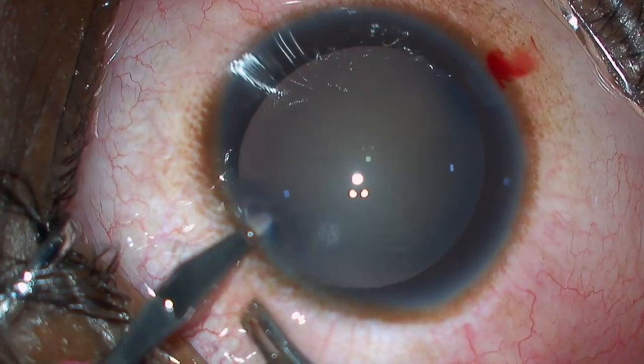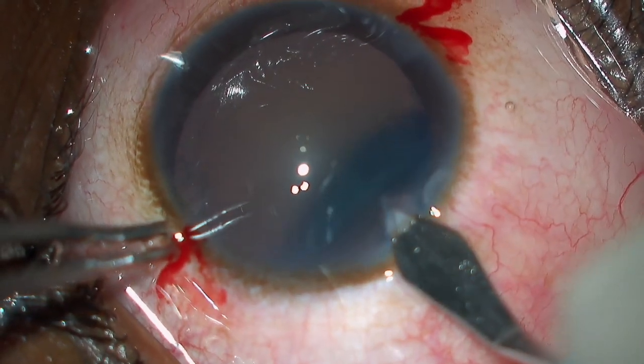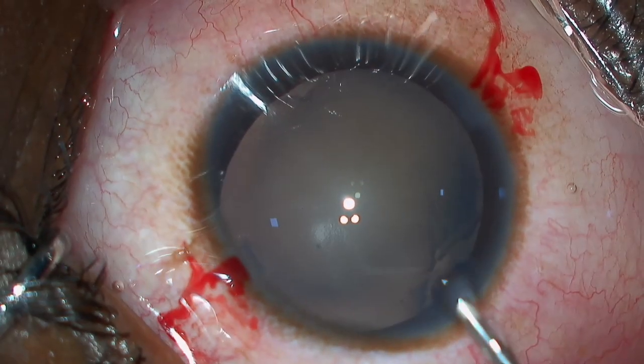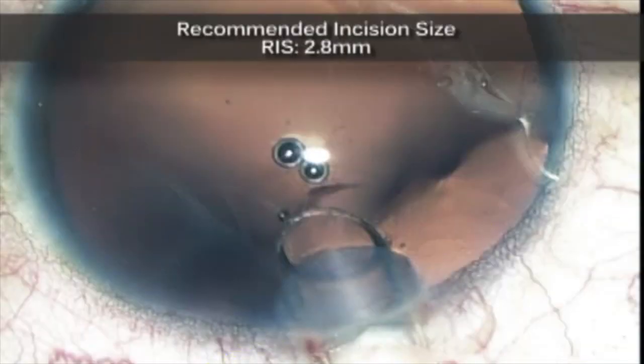The side ports are made on either side and then the keratome entry — a clear corneal incision with a 2.8 mm keratome — is done. Do not overfill the anterior chamber; just touch the eye to check the firmness.